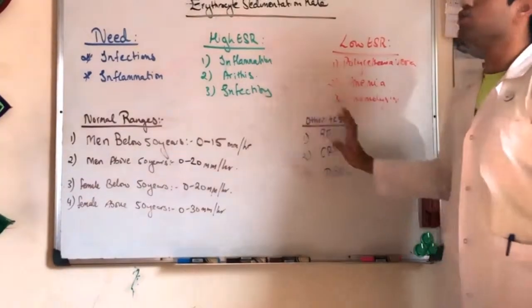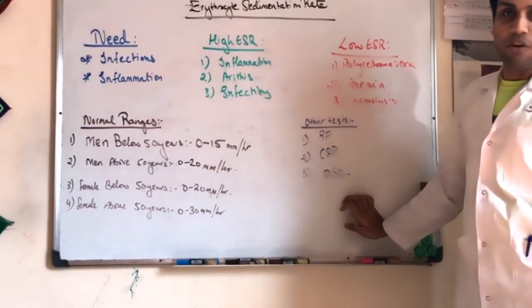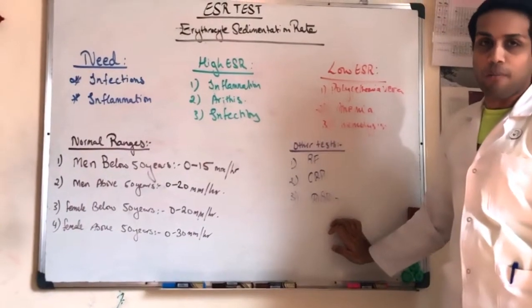Now, this is the whole story behind the ESR test. Let us come forward and see what materials are required in performing our ESR test.